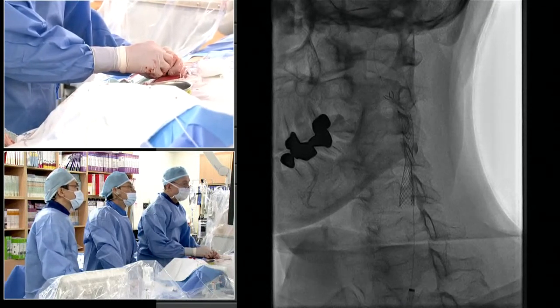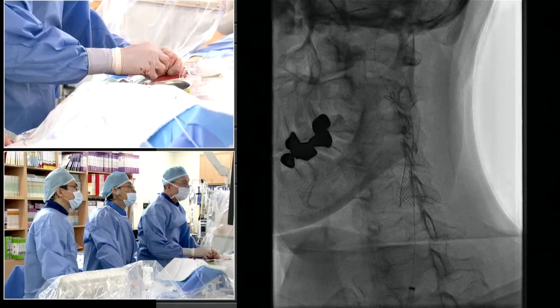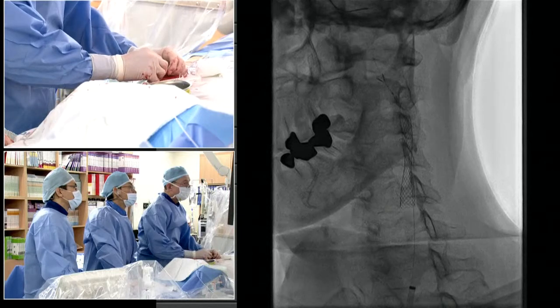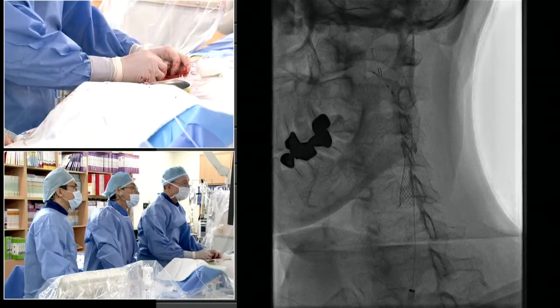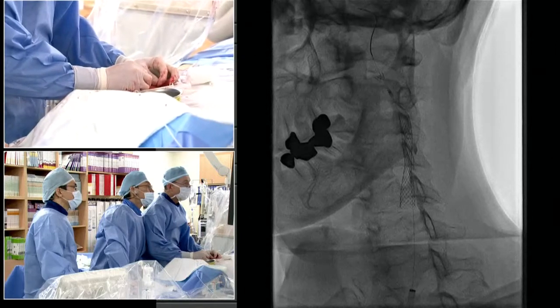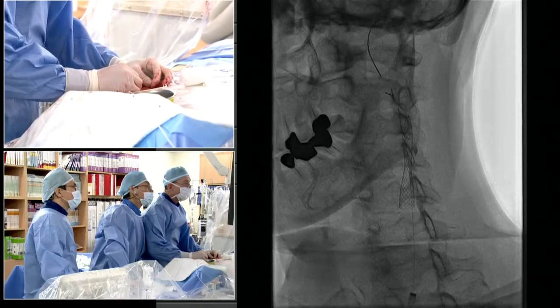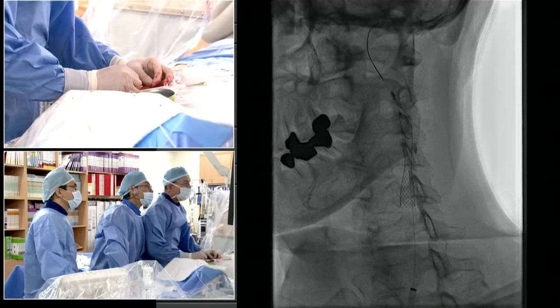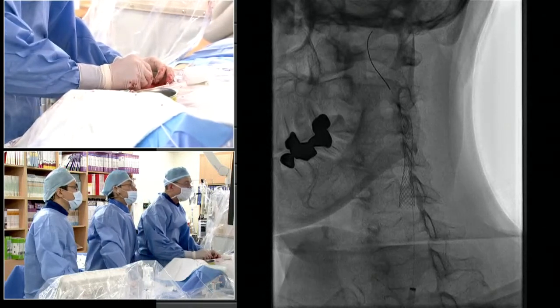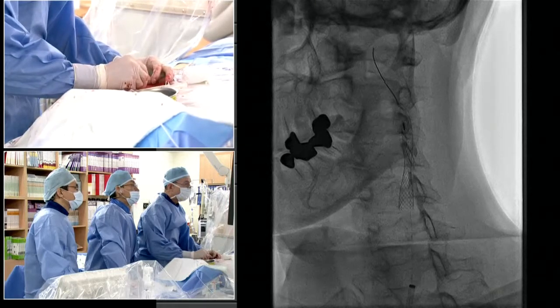So I'm always cautious at that step right there, bringing the recapture device right into the stent. So we'll hold the recapture device there and draw the wire back, which then pins the NAV6, collapses it, and then at this point also we want to bring it back very slowly to make sure that we're not snagging on the stent.